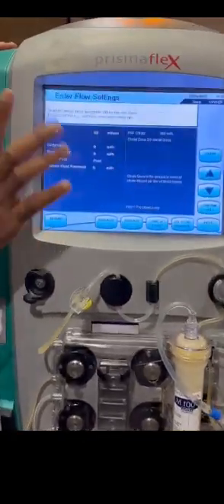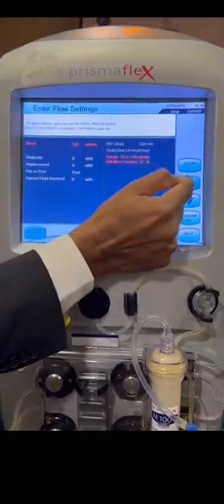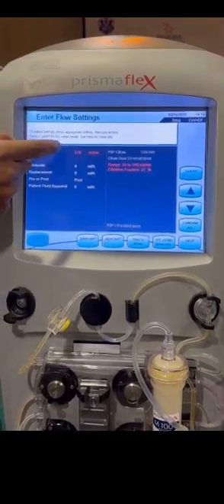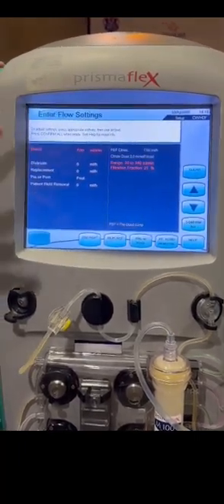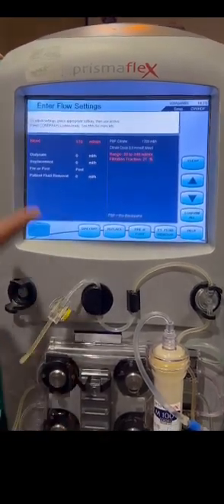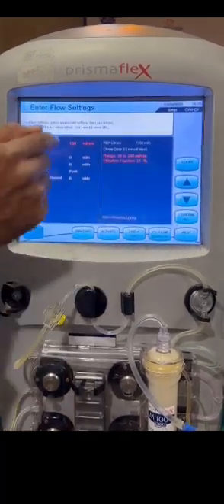Then here our prescription is. So in prescription we have blood flow in ml per minute. We can make it 150, 200. Minimum it starts from 10 ml, but we have to keep at least 100, because blood stasis leads to clotting. So I keep 100. Okay, 100.